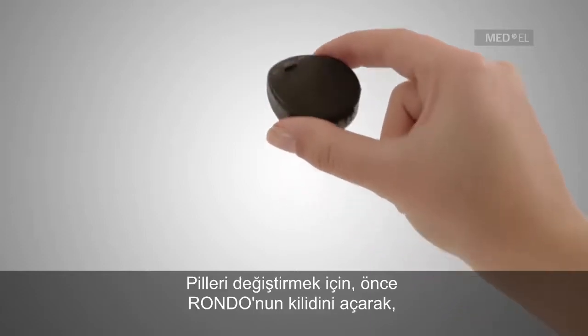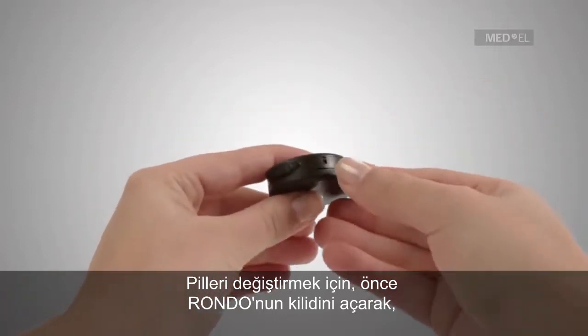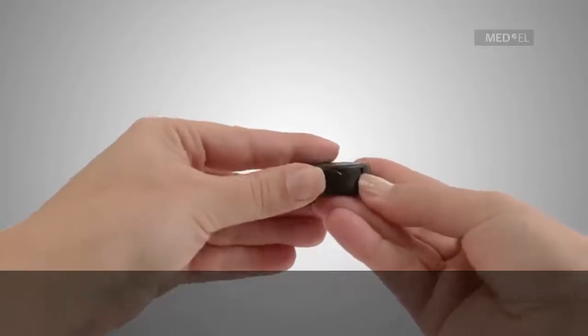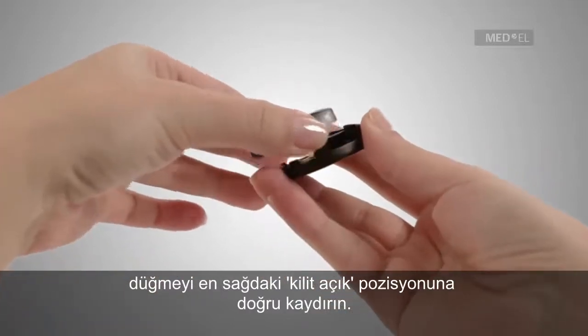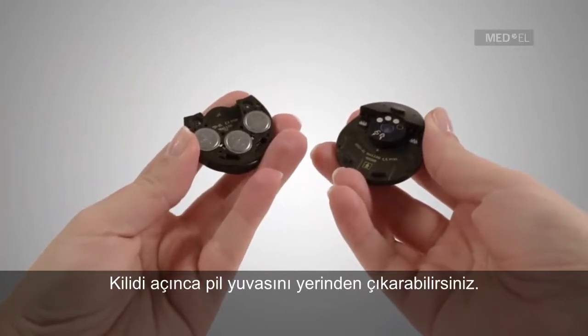To replace the batteries, remove the battery pack from the control unit by first unlocking the Rondo. To unlock the Rondo, use your fingernail to push the release lever down while sliding the switch to the unlock position at right. Unlocking the Rondo allows you to lift up the battery pack.